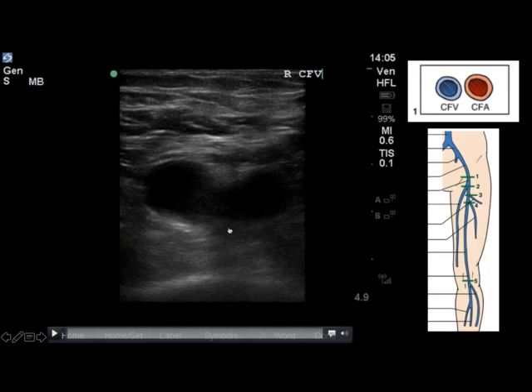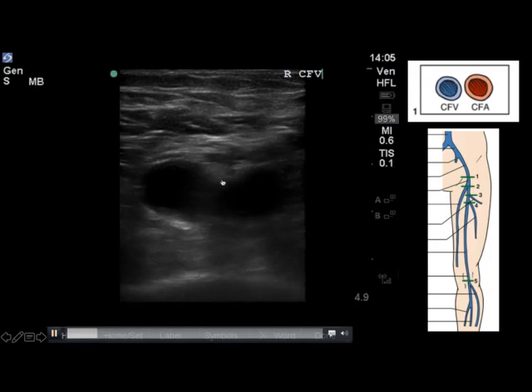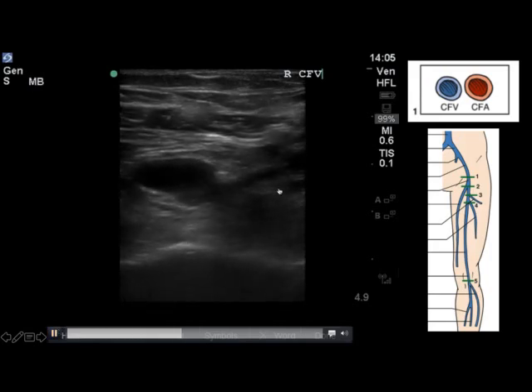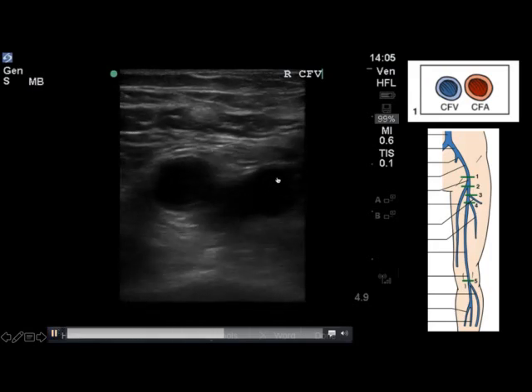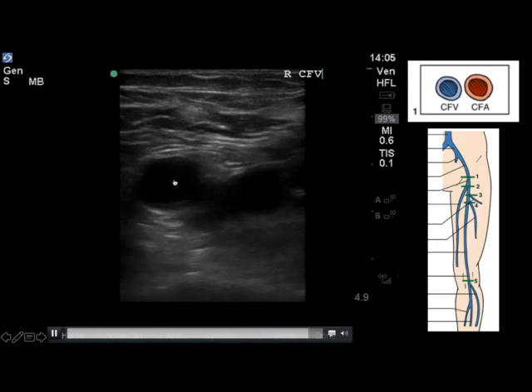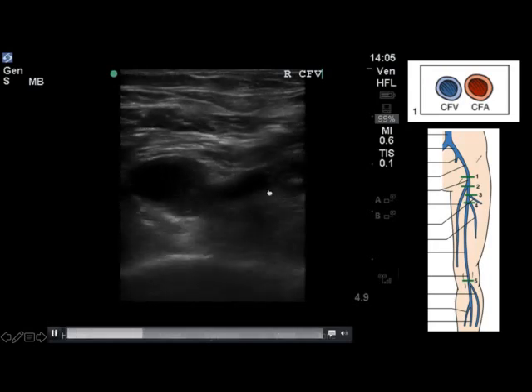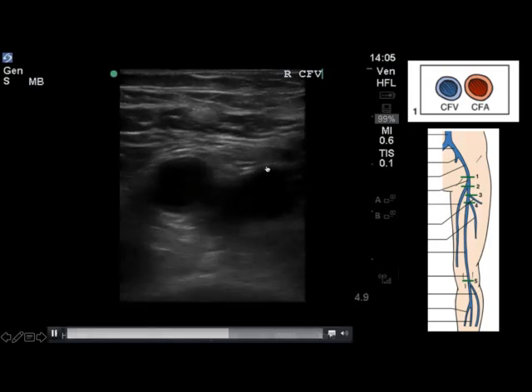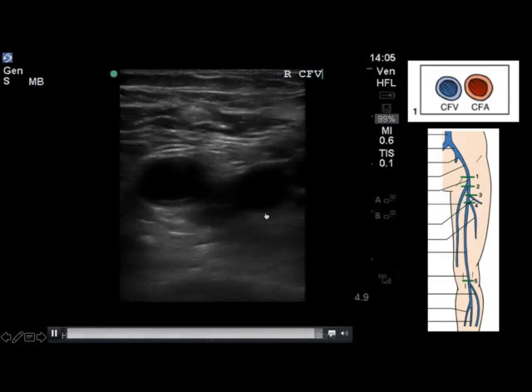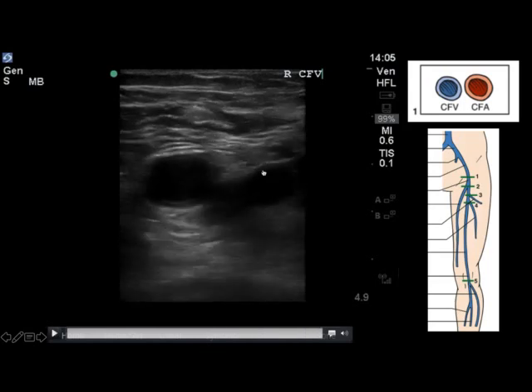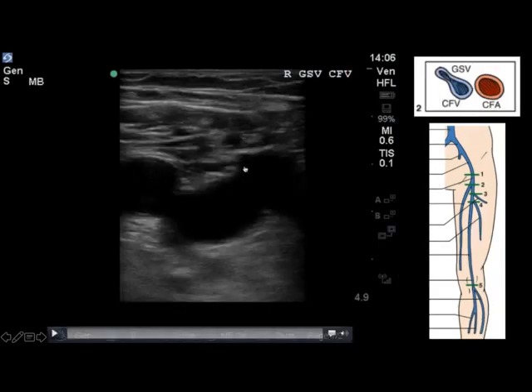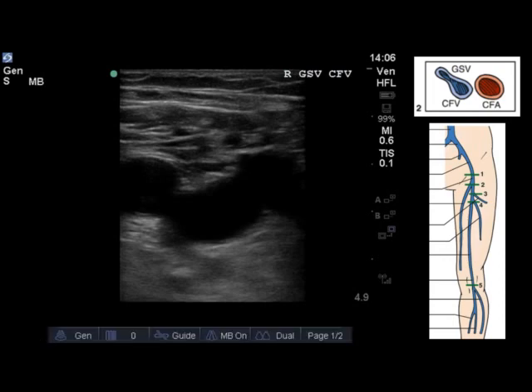Now moving over to the patient's right leg — the right side of the screen is going to be the medial side — you have the common femoral vein lying medial to the common femoral artery. We're able to give things a nice press, oppose the anterior and posterior walls of the vessel, and satisfy ourselves that no clot is present at this key site.